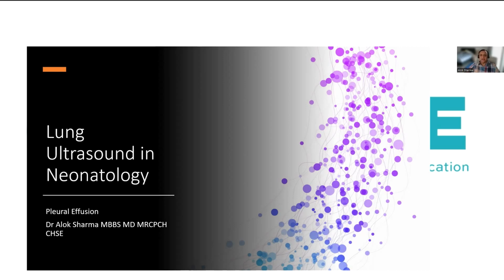Today's webinar is the last session that we're presenting with regards to a 3-month course that we've been running on lung ultrasound and neonatology. We've had about 35 participants who've joined us since January, who've been going through approximately 17 competencies for learning lung ultrasound and neonatology through this online course. And what I'm going to do is give you a little bit of a flavor today of how you use lung ultrasound in neonatology to help diagnose and manage pleural effusions.